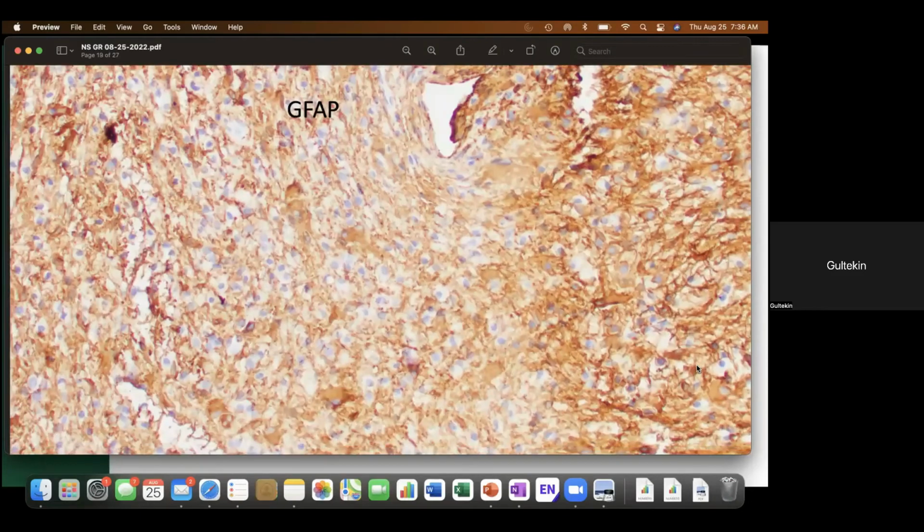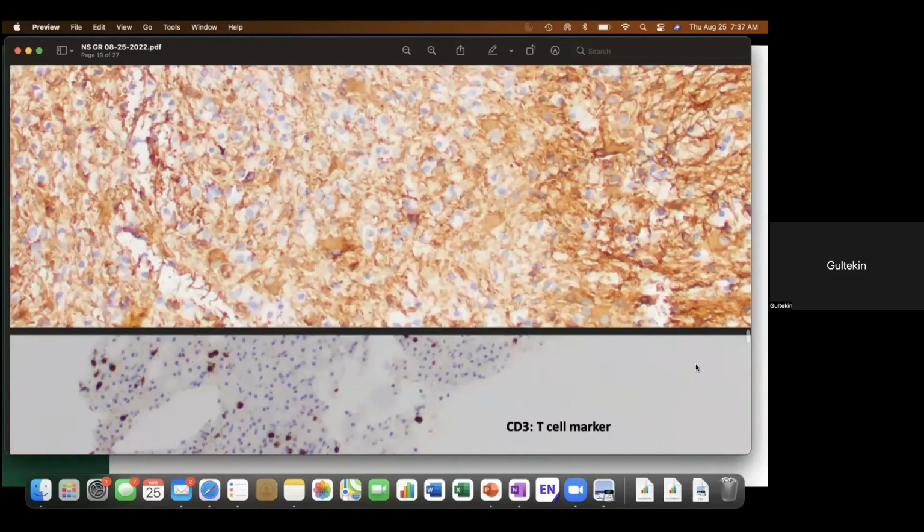And there is glial fibrillary acidic protein positivity. So there is the inevitable reactive gliosis, which makes things a little difficult, again, in case the surgeon sent it for a frozen section. It may be a difficulty that I'm just demonstrating here. Next. Is there any other?